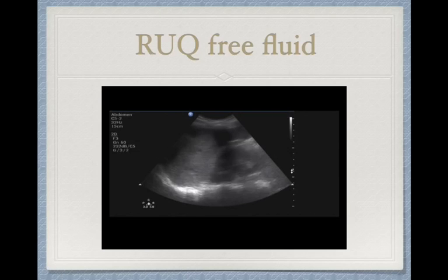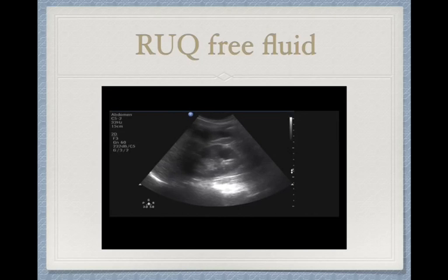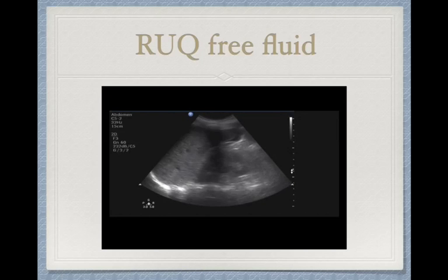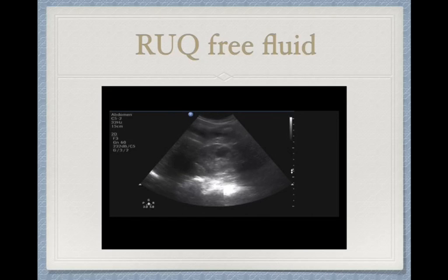So that's why it's really important to focus in on all four areas of the right upper quadrant. So yep, right here. All right, so let's move on.